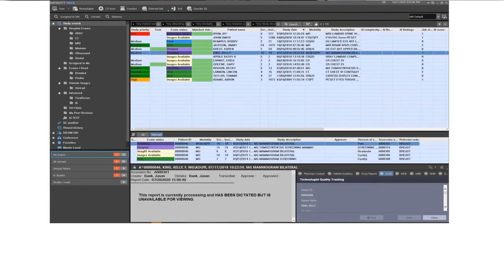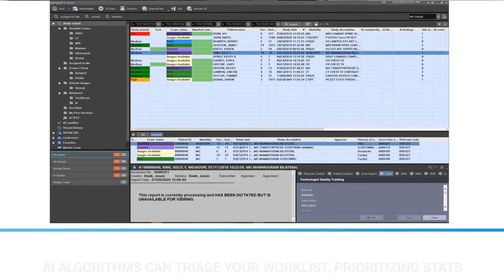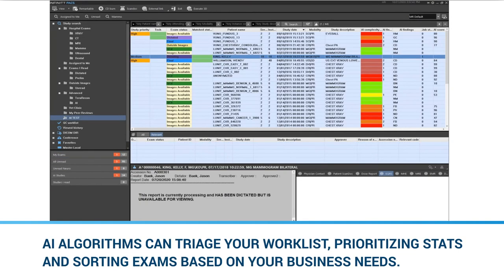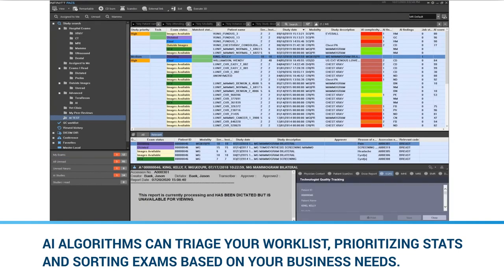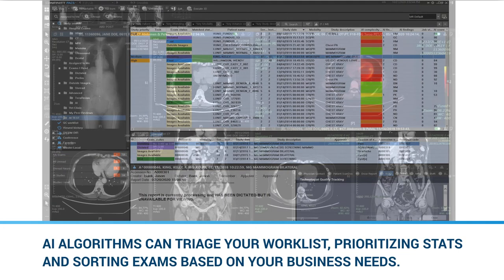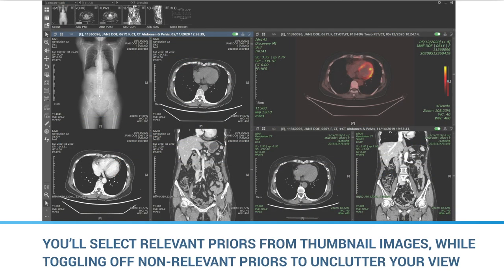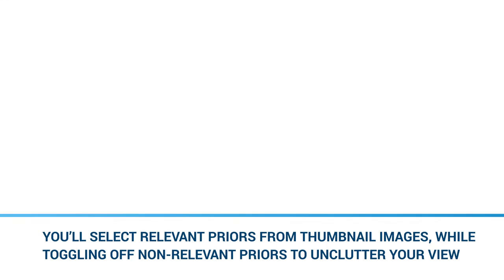Before you've even started reading, AI algorithms can triage your worklist, prioritizing stats and sorting exams based on your business needs. You'll select relevant priors from thumbnail images while toggling off non-relevant priors to unclutter your view.